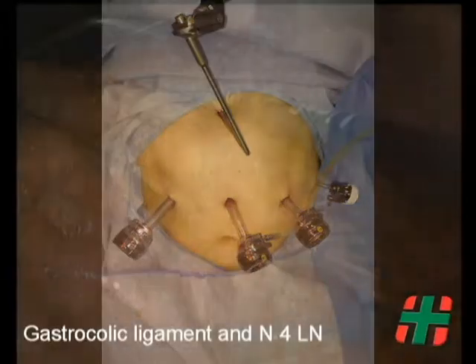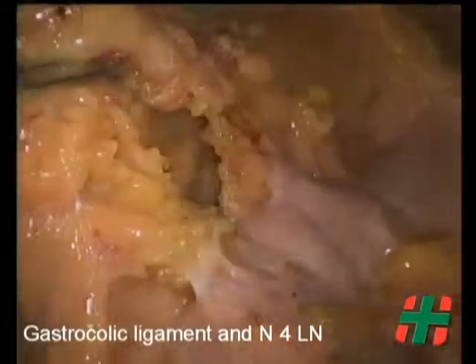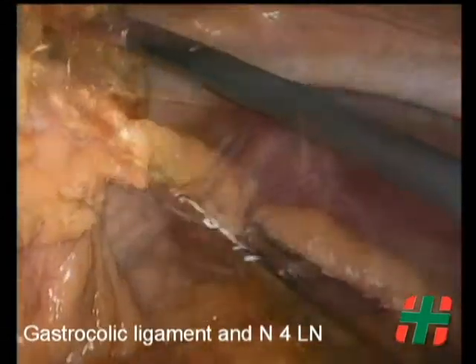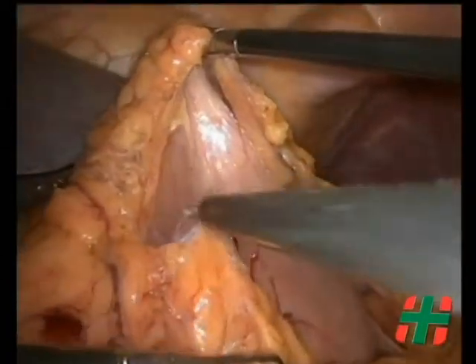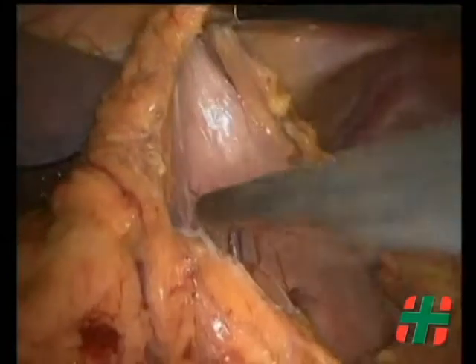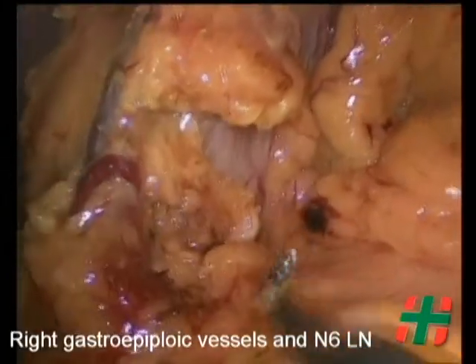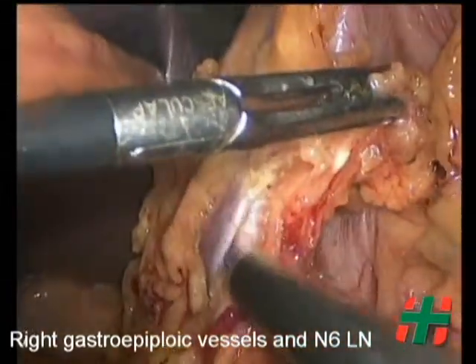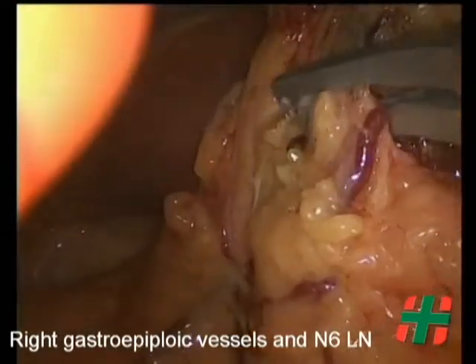The first steps are common for both procedures. The gastrocolic ligament is divided along with the number 4 lymph nodes. The right gastroepiploic vein and artery are then divided using polymeric vascular clips, clearing station number 6. Subpyloric lymph nodes are also resected.